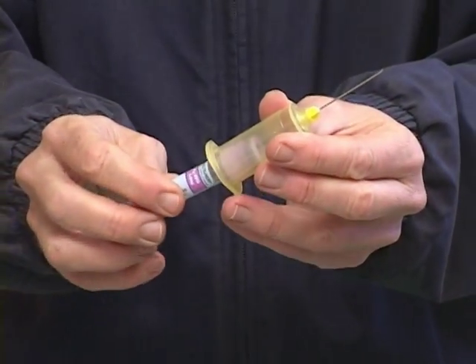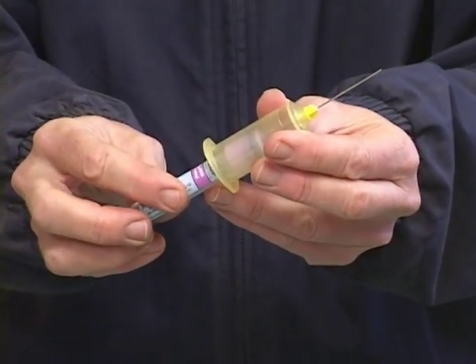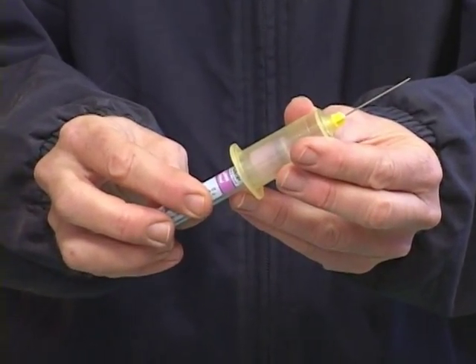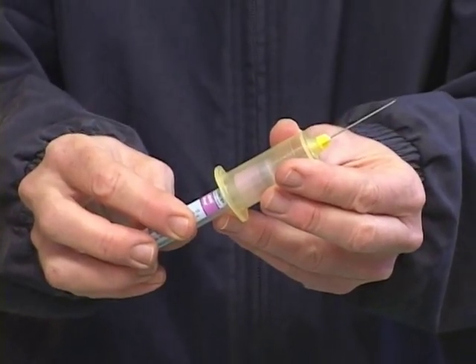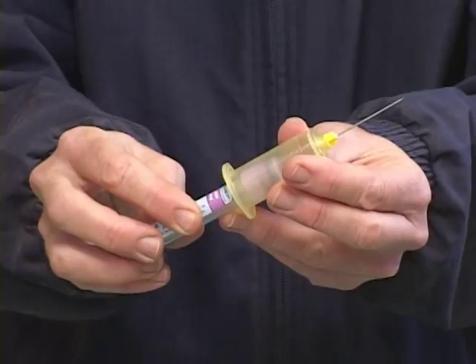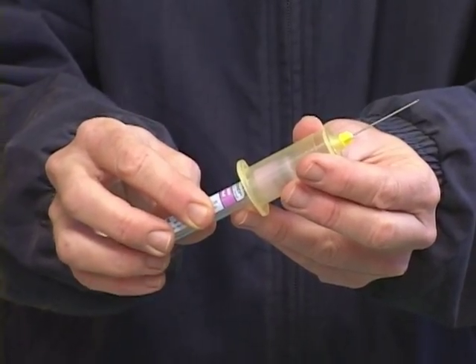The tube fits right up in — you push it onto the needle and everything's nicely stabilized. Not all large general practitioners use stabilizers, but it depends on what you're comfortable with, and certainly you can do it either way. So now let's take this equipment and we'll go outside and demonstrate on Red.